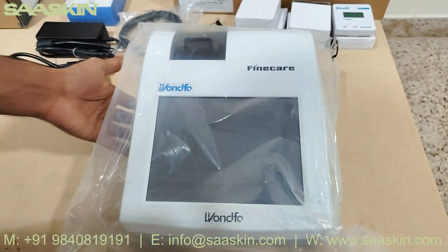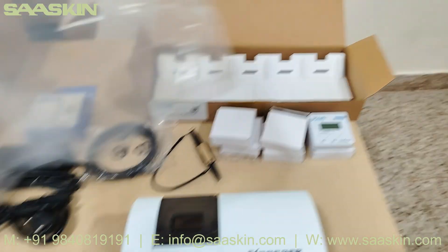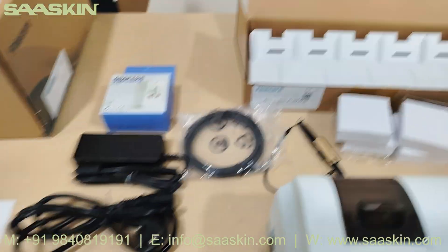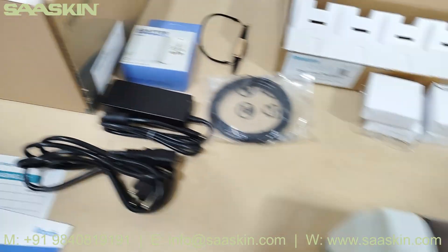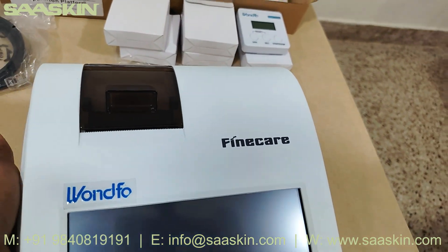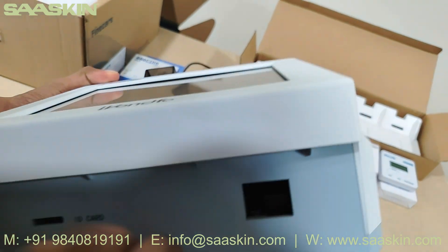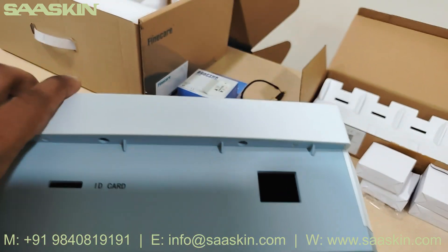This is the Fine Care FIA Meter Plus analyzer. It is very handy, very portable. At the front you can see the slot where we insert the ID card, and then there is the slot for the sample.